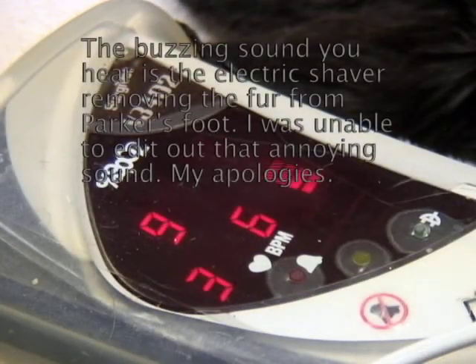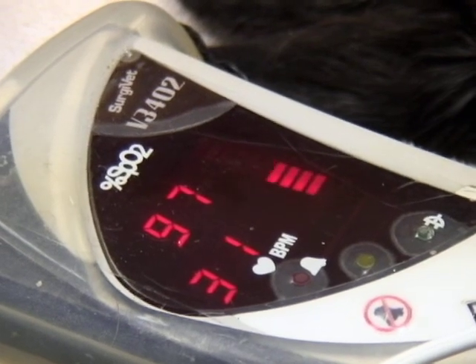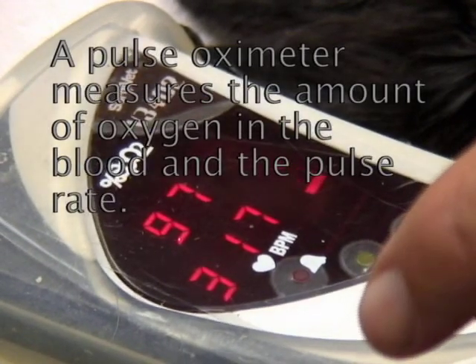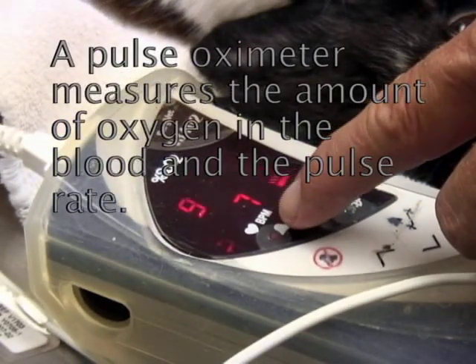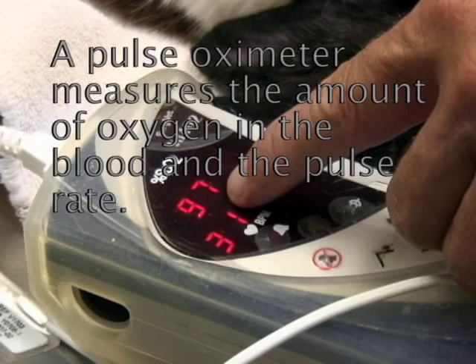We've got this guy sedated, again he's breathing oxygen and sevoflurane. We've got him hooked up to a pulse oximeter. This is his pulse rate — 317 — and this is the percentage of oxygen in his blood: 97%. It's very high because he's breathing oxygen.